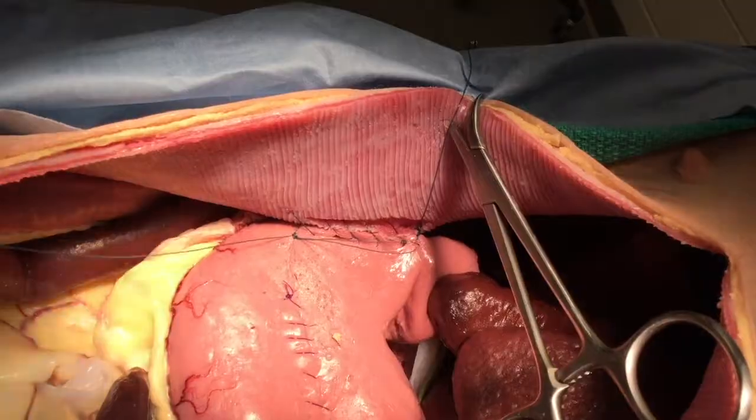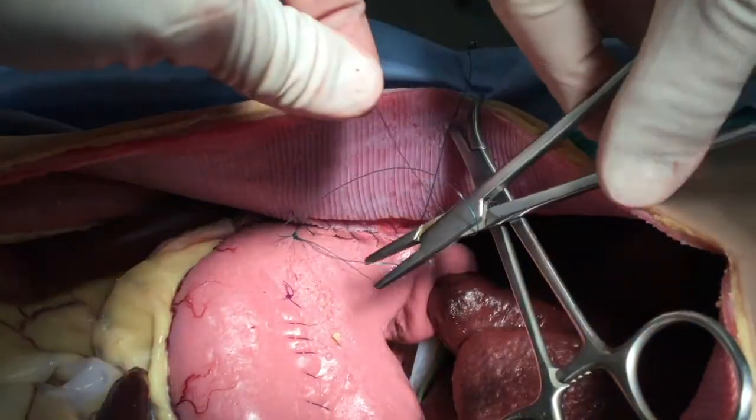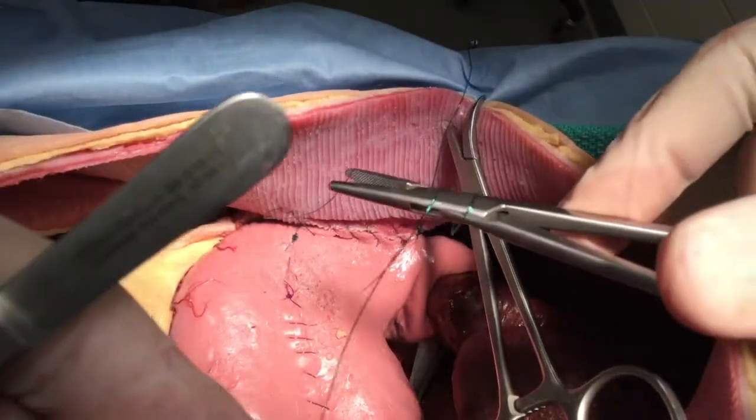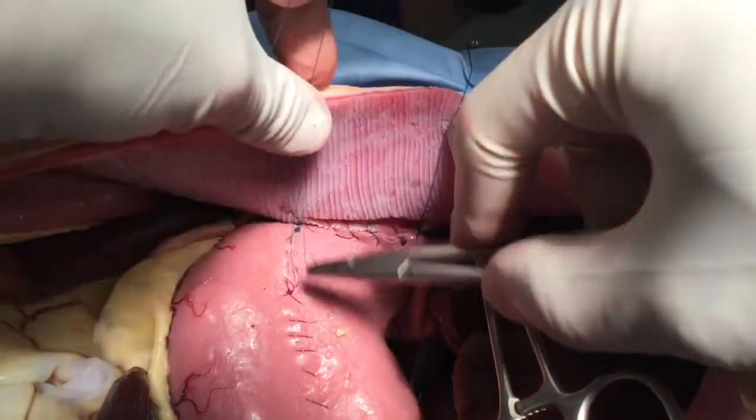We are now tying the suture strand to itself, finishing it towards the caudal aspect of the gastropexy site.